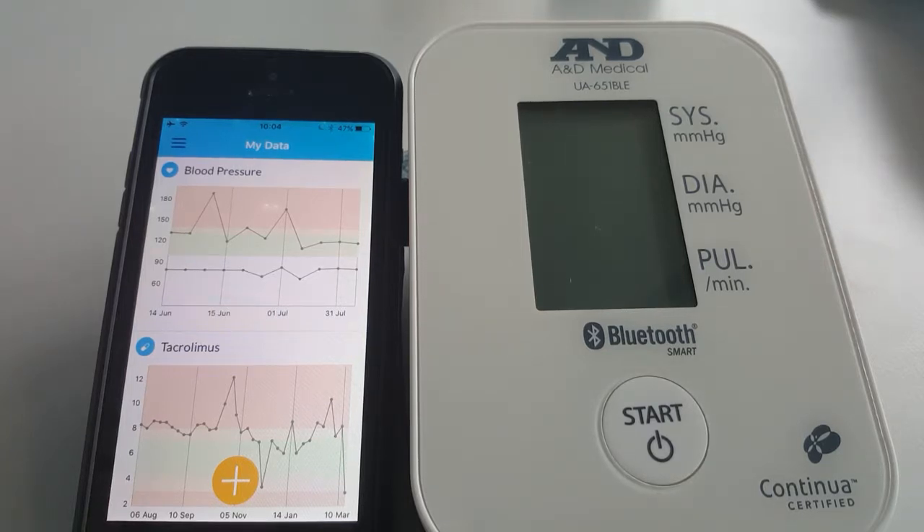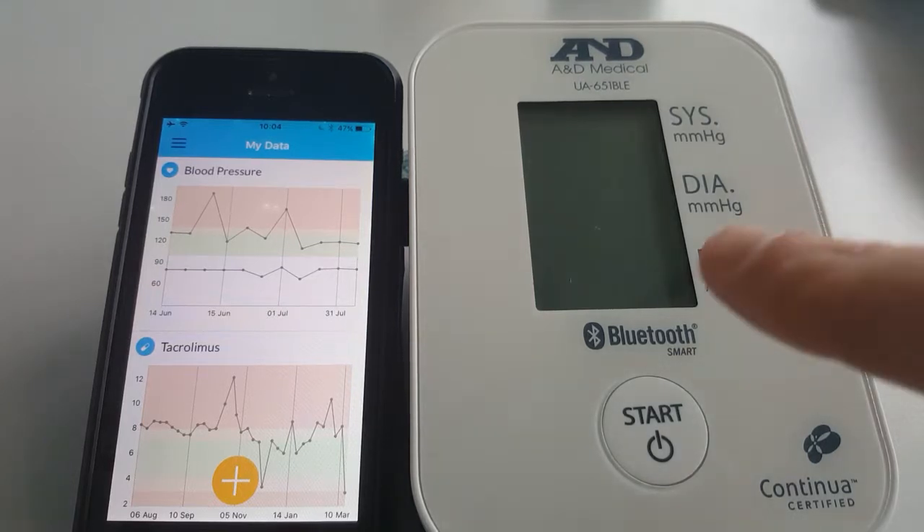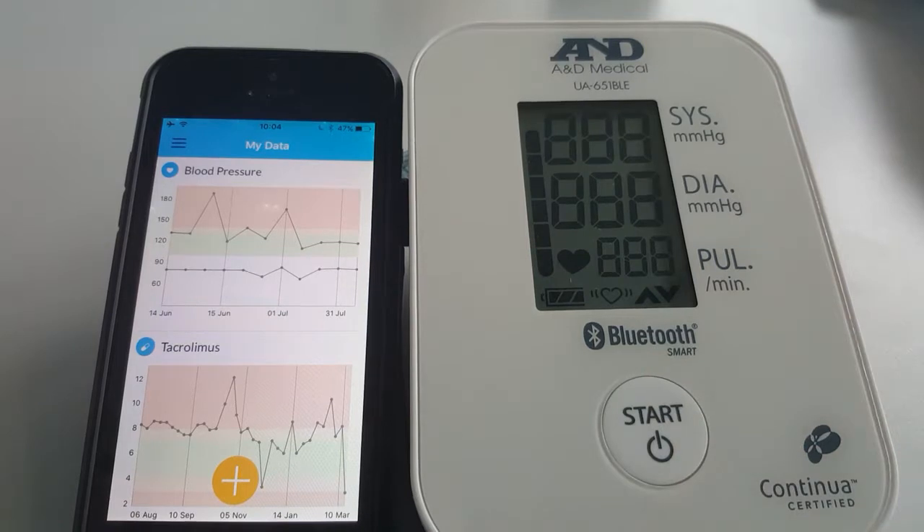Have the Patient Empower app open on any screen when conducting your measurement. Press the start button on the monitor. You should see the monitor start to work and the cuff begin to inflate. Please remain still and silent for the duration of the measurement.